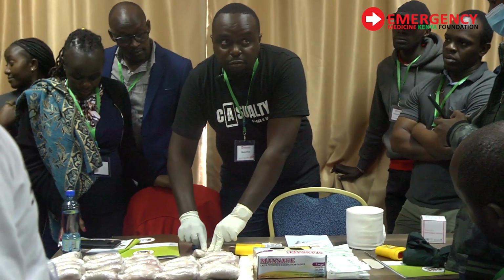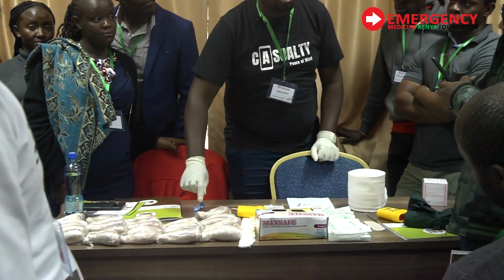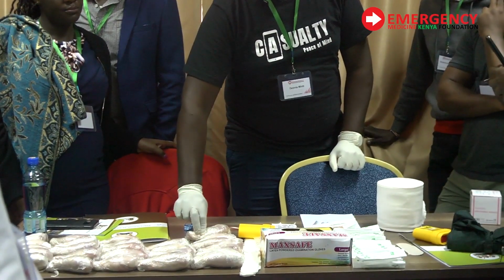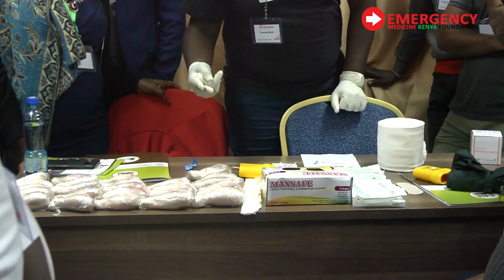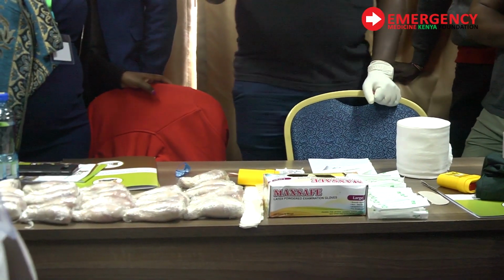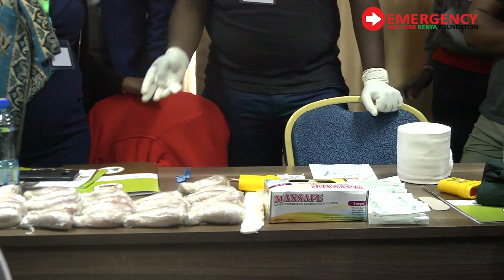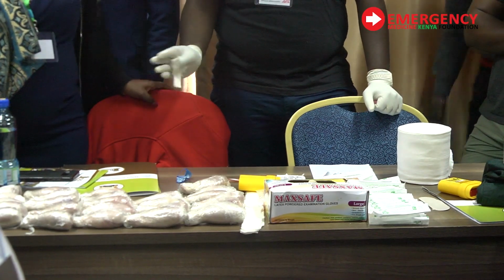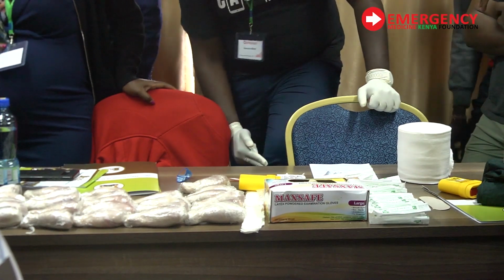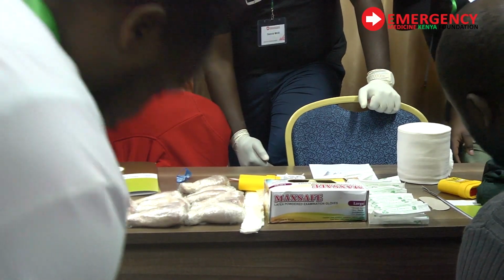But for the proximal tibia site, which is the commonest site, how do you locate it? It's not 10 centimeters, it's 2 centimeters. Actually, is it 2 centimeters or 2 finger breadths? It should be 2 finger breadths, that's 4 centimeters. So it's 2 finger breadths below the tibial tuberosity on the medial surface. That is a surface that is flat. So I'm going to just hold that part, and each one of you can try to hold there. I've already said it anatomically.